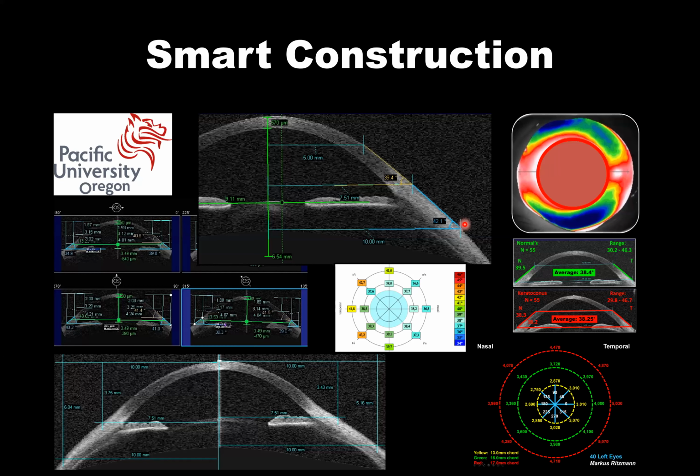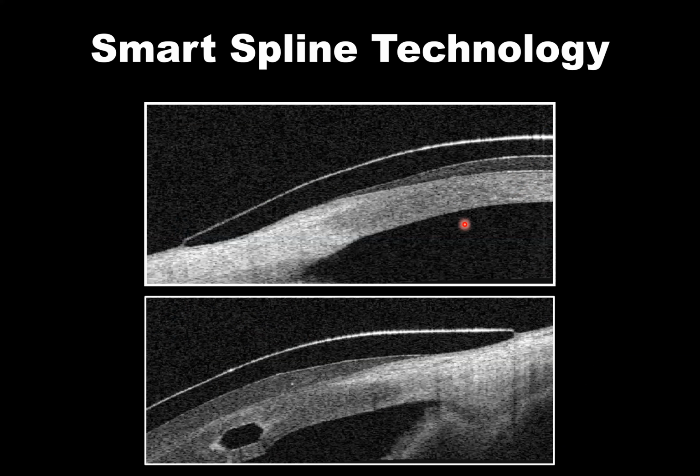And using the spline technology, it creates this incredibly elegant relationship of lens to surface vaulting, and the ability to alter zone 3 to increase the limbal vault, and to alter zone 2, the peripheral corneal zone, to lift or drop the sagittal depth of the center.